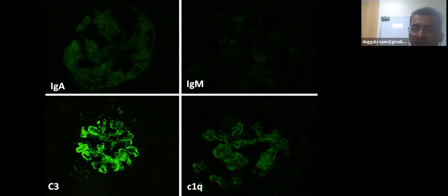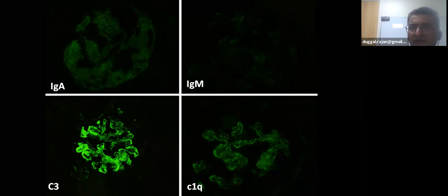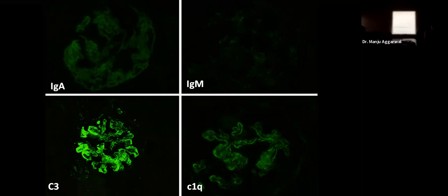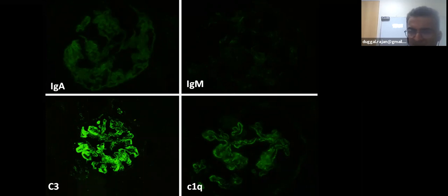I remember there was one case when I was in Medanta in 2011, I labeled that as an idiopathic membranous. And after 3 years, that female came with a recurrent nephrotic syndrome. And this time, again, the immunofluorescence pattern was not showing any C1q staining, but we were doing PLA2R and thrombospondin. We were doing IgG subclasses. And then there was a serology also, which was consistent with lupus. So I'm very sure that we are underdiagnosing class 5 membranous and we are labeling them as primary idiopathic membranous.